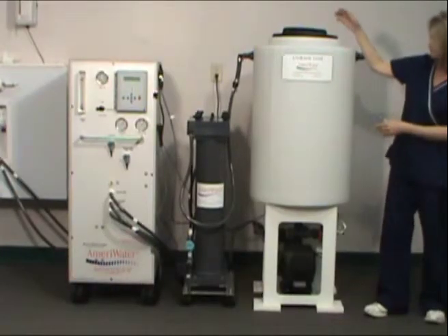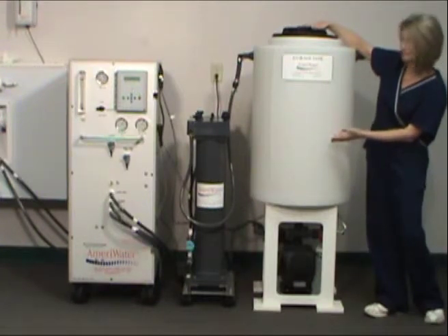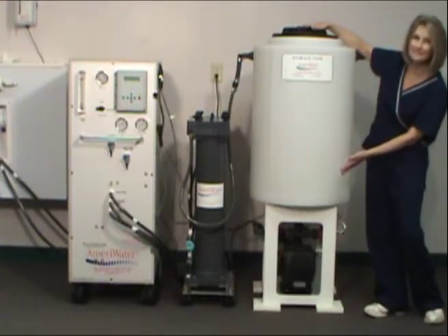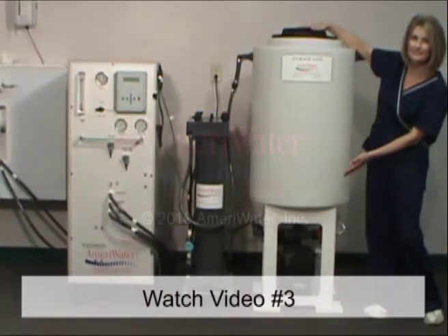Your AmeriWater high purity water system for central sterile services is now ready to begin operation. To learn more about the startup of the system, watch part 3 of this video series from AmeriWater.